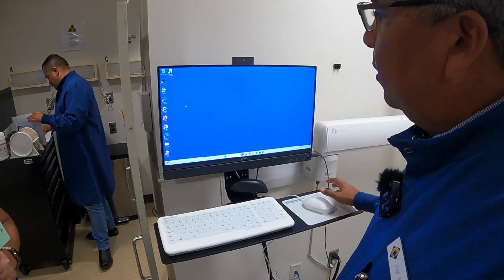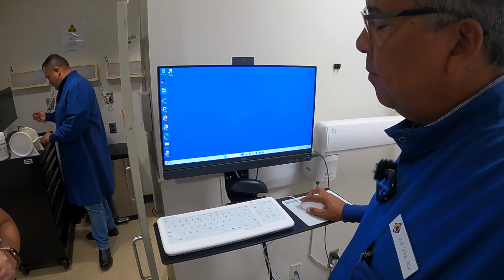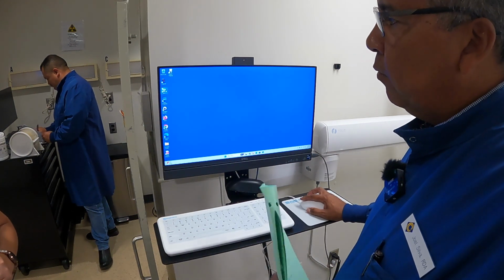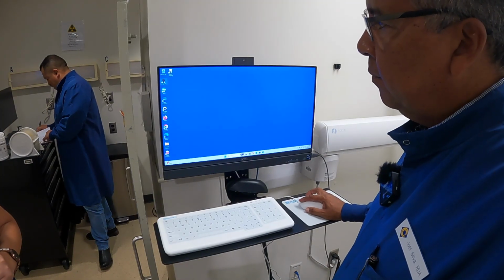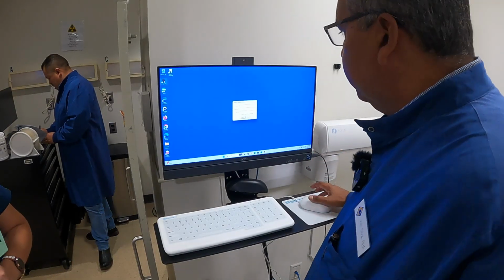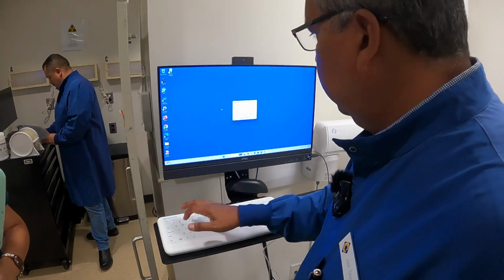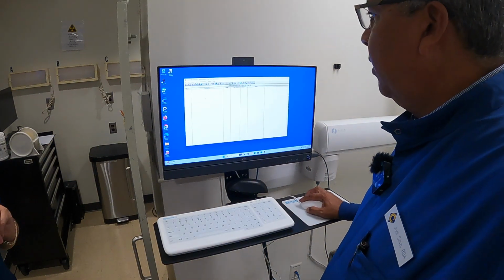Okay. So there's actually a couple of things. We're going to be working through this application called Dexis. But the way that we're going to access it is not through here. It is through this chair kind of a tab right here. So we're going to go ahead and click on that. And then I gave you all passwords already. And then it gets you into this particular area right here.